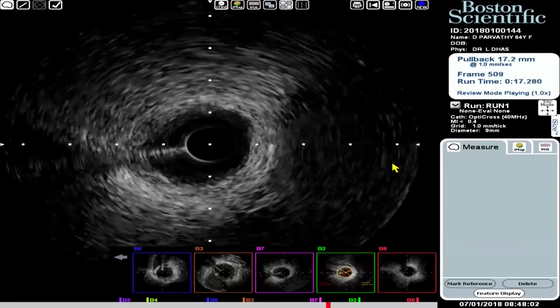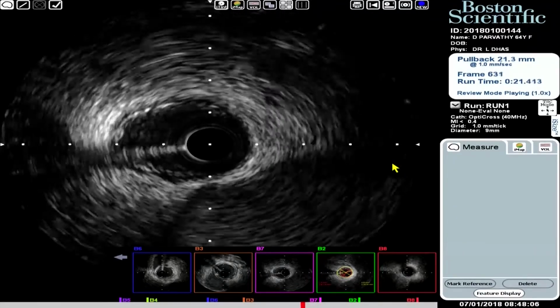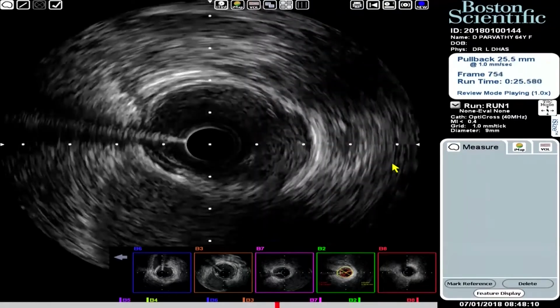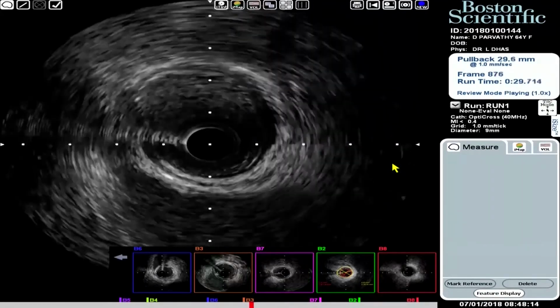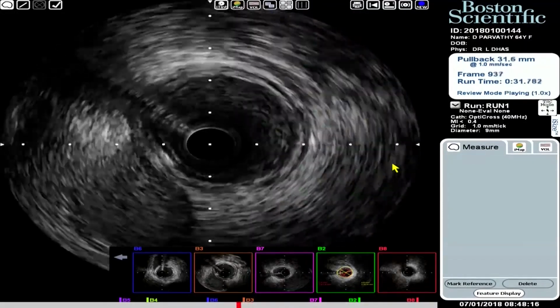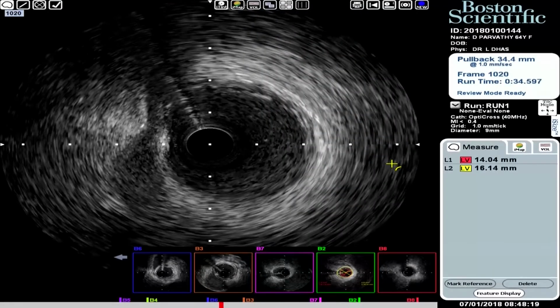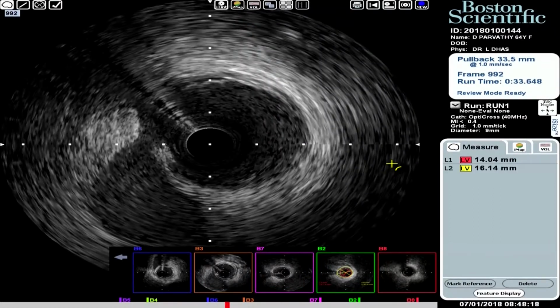And proximal to the lesion, the vessel looks very good. So it's a good landing zone, there's no block. Distally, the vessel was around 2.3 millimeters and approximately around 2.5. So we decided to put a 2.25 stent. Can you see something at the 7 o'clock position? That is your great cardiac vein that comes along.